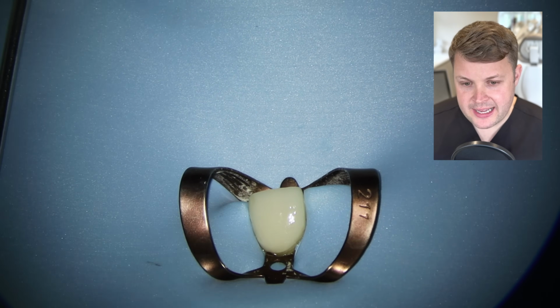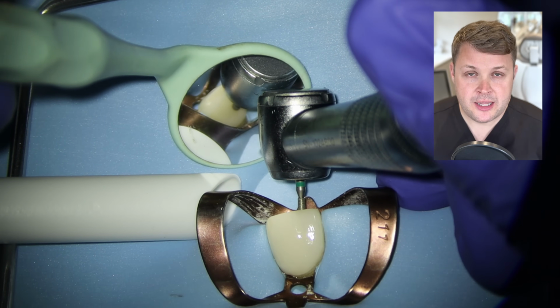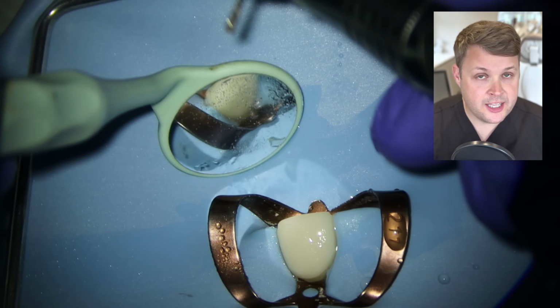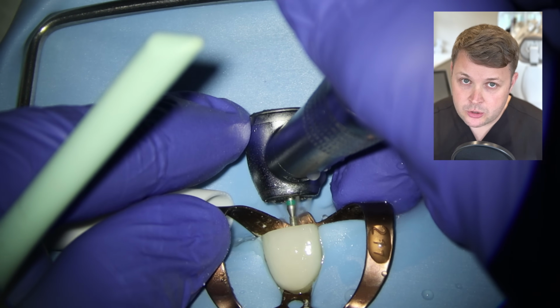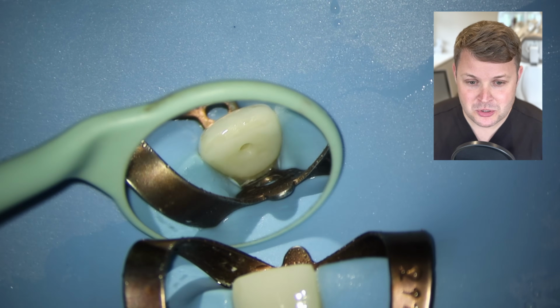I'm now going to start my initial access, and in this case I'm going to use a pear-shaped burr. It's too short for us to do the proper access, but I feel like with these pear-shaped burrs, it's got quite a wide base, and also I think it cuts through crowns a little bit better. And I'm just doing a little bit of drilling, having a little look, a little bit of drilling, having a little look, and sometimes you feel like you've drilled loads and loads and you have a little look and you've not gone down that much at all.